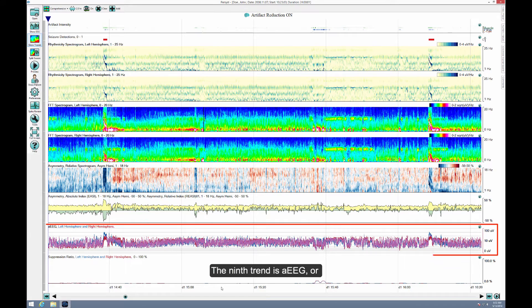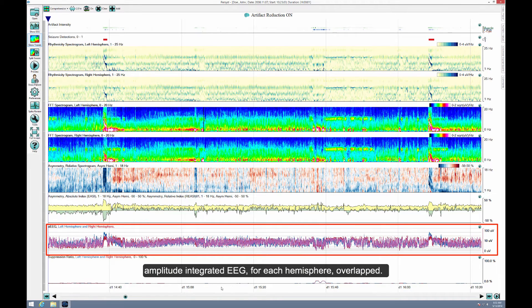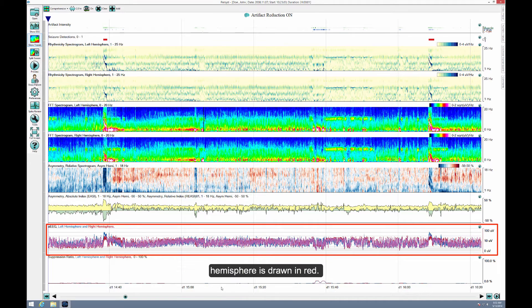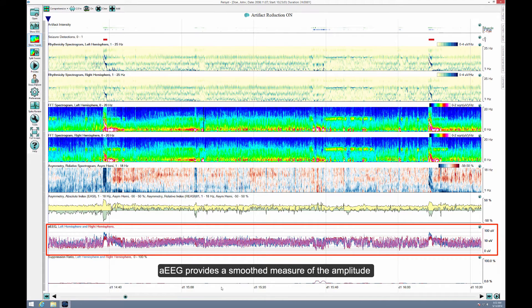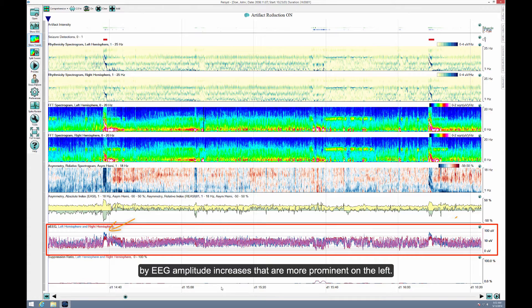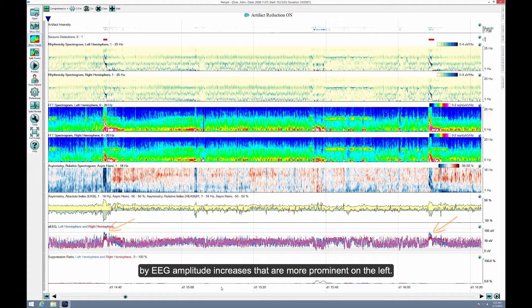The ninth trend is AEEG, or Amplitude Integrated EEG, for each hemisphere, overlapped. The left hemisphere is drawn in blue, and the right hemisphere is drawn in red. AEEG provides a smooth measure of the amplitude envelope of the EEG. The patient seizures are accompanied by EEG amplitude increases that are more prominent on the left.